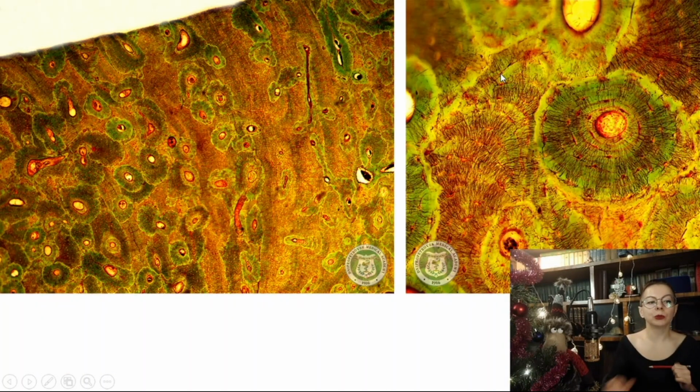Then about bones, we also have to distinguish lamellar bone, but this specimen is usually green and brown in color, very unique. Usually specimens are purple and pink, and just by the color you can distinguish lamellar bone tissue from all the other specimens, green or brown. Of course, you can see here osteons with a Haversian canal inside with osteocytes, and that's the feature of bone tissue.